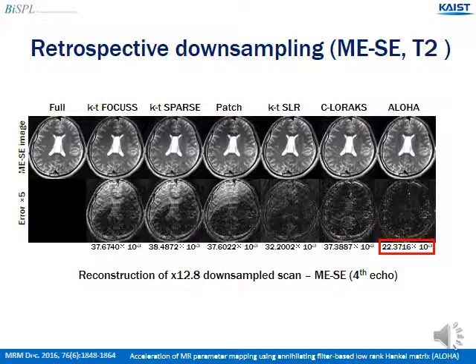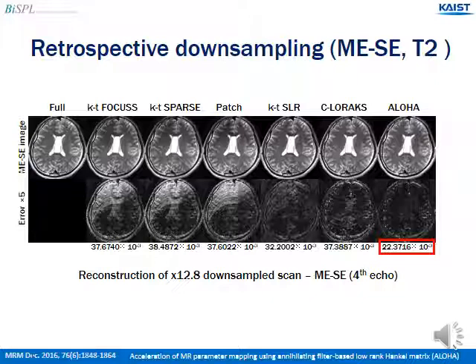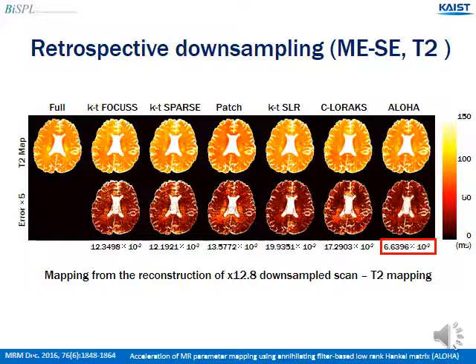Here are the reconstruction results from 12.8 times retrospectively downsampled T2 mapping data. Here also ALOHA outperforms the others. These are the T2 mapping results, and as you can see, ALOHA shows minimum errors compared to the other compressed sensing algorithms.